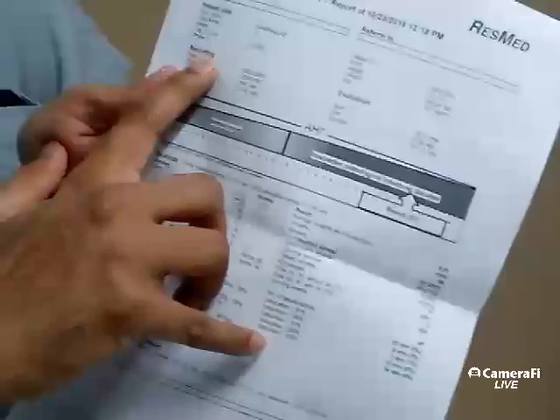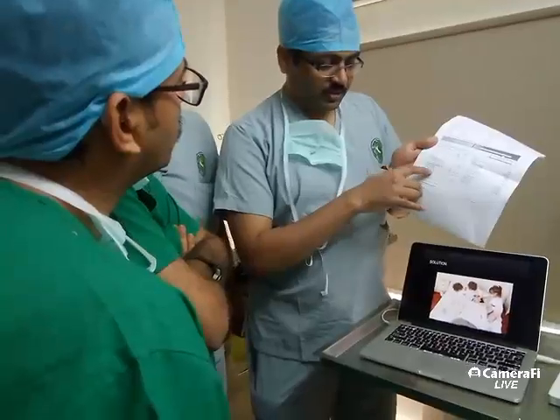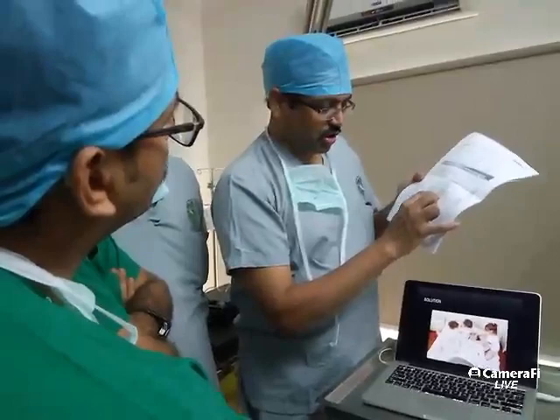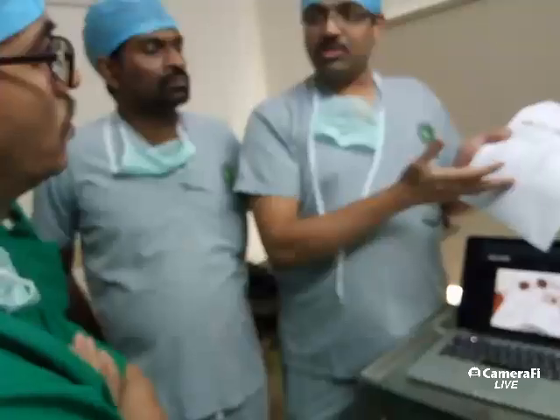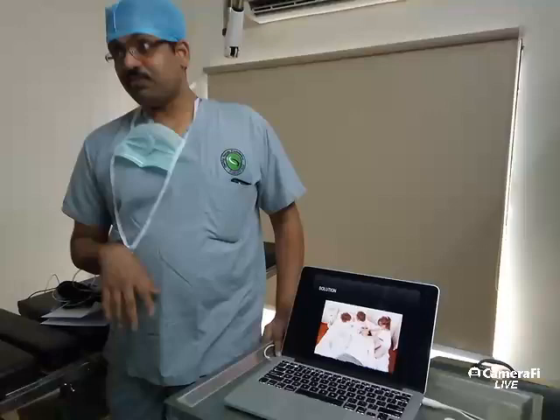Example here, see the recording time is 7 hours 41 minutes, whereas the sleep time or evaluation time is only 5 hours. The importance of this is this patient is having desaturation, and then you worry. Except for that, you don't have to worry much. That is not going to lead to many complications, provided they don't worsen. By 15 to 20 years, patients can have ischemic heart disease, and also urinary impairment and sexual dysfunction. These are all the complications.